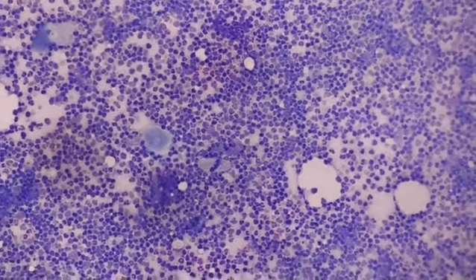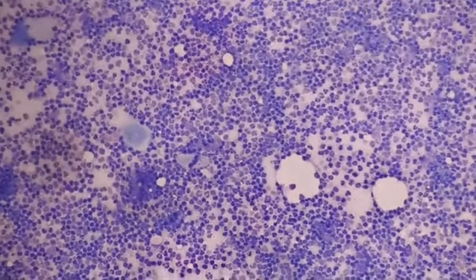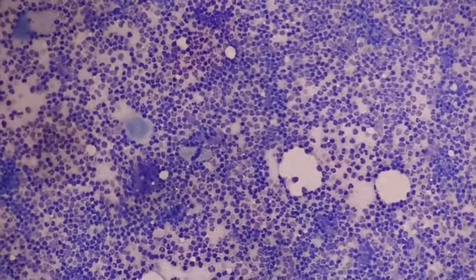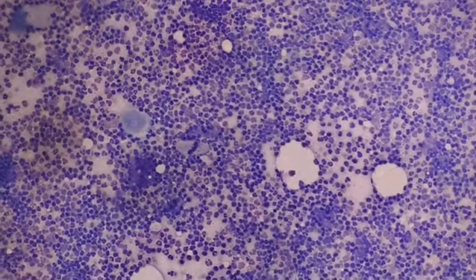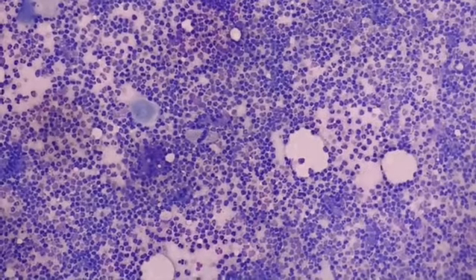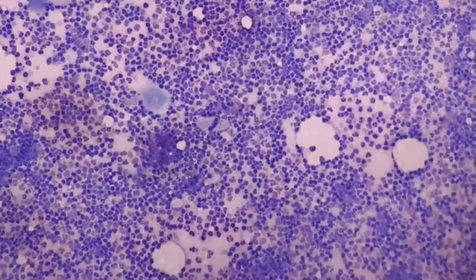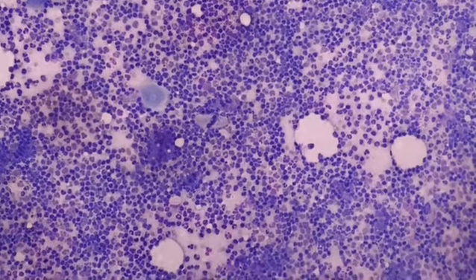So these components, considering your anucleated squames, keratinous debris, then your dense neutrophilic infiltration, along with chronic inflammatory cells, that is lymphocytes and plasma cells, foamy histiocytes, and sometimes cholesterol crystals, make you arrive at the diagnosis of subareolar breast abscess.